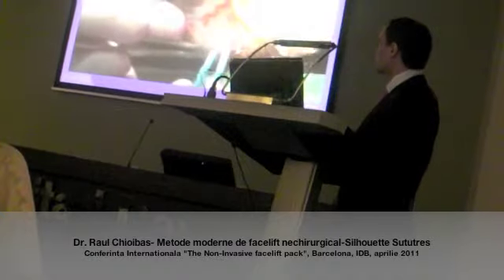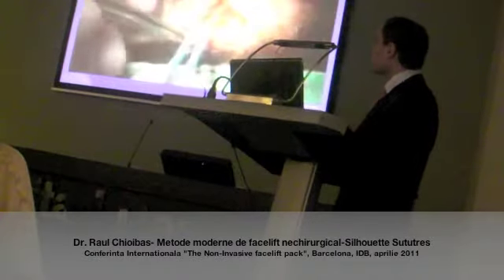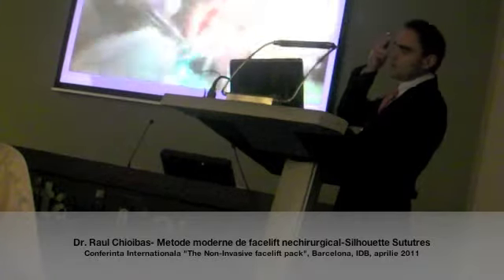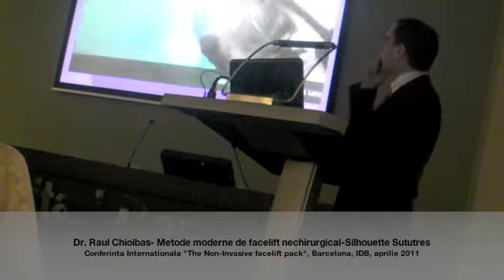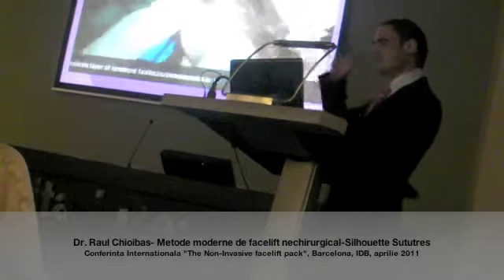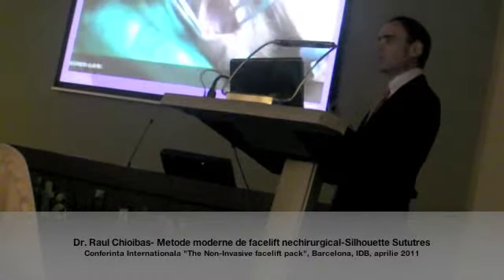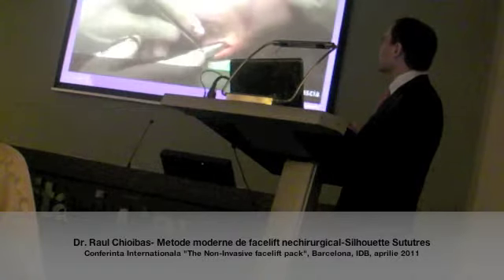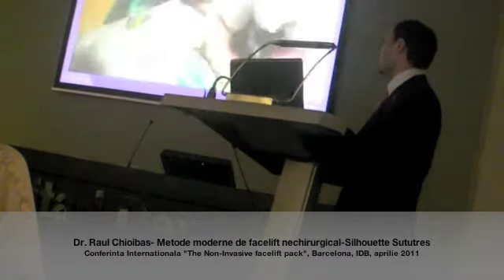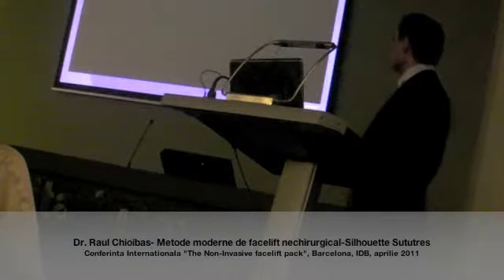Then we go down to the temporal fascia, and from this point we can dissect the whole temporal area, also without needing an endoscope, because if you use a frontal lamp, you can see this whole area very clearly, and you can dissect it with scissors and dissectors. Okay?